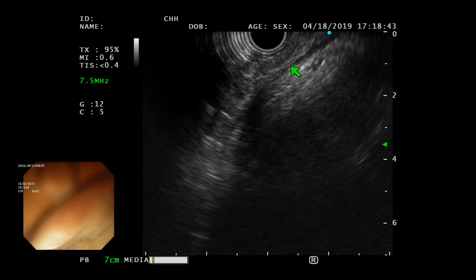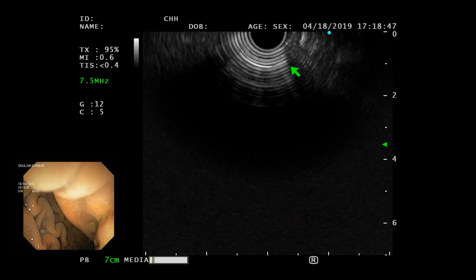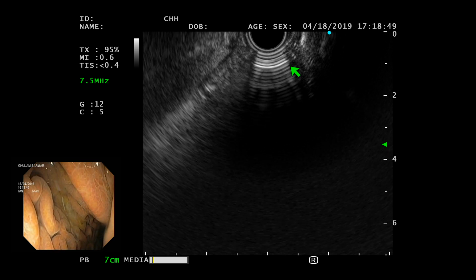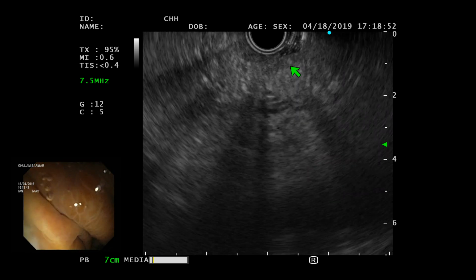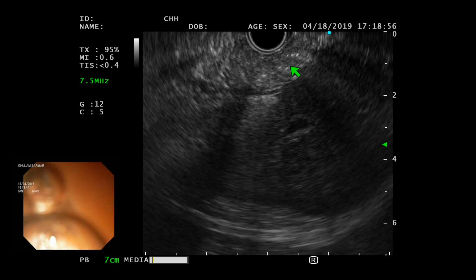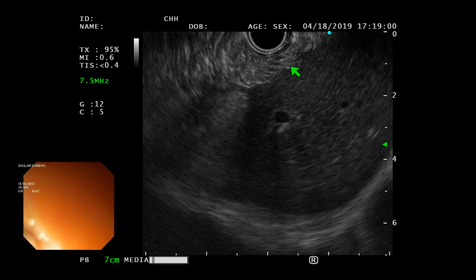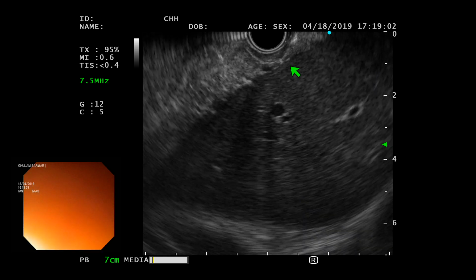Now just lay your hand down, and rotate the scope a little bit downwards. See? Now follow that towards the opposite wall. Okay, big wheel towards you a little bit. Stop there. Suction. Big wheel towards you further. And look at the EUS screen. You have a liver right there. Big wheel towards you. Keep rotating to the right.